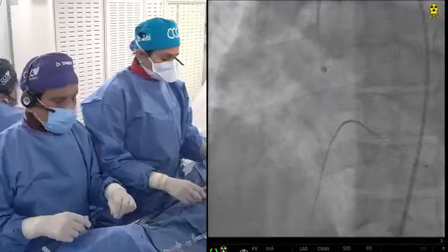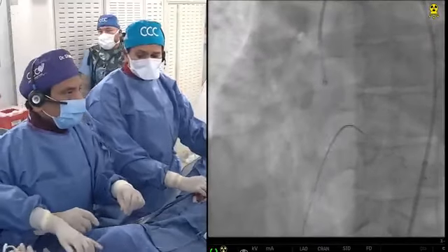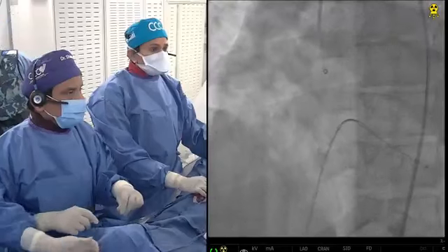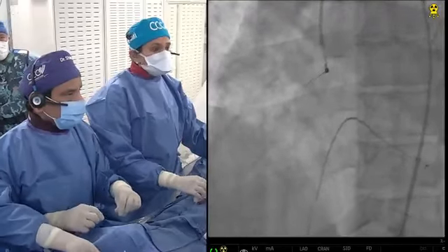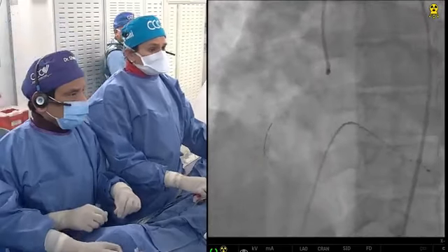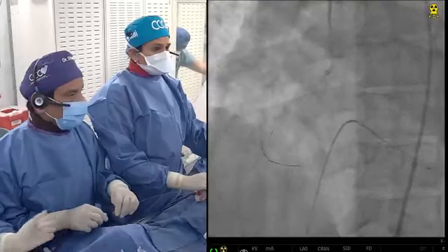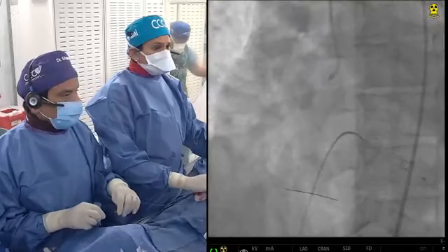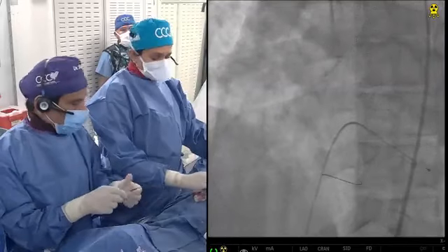Now hold it here. And you come here. You'll show it, Sabina. Not yet. I'll tell you when. Good. Anyway, bring your catheter because we are in the RV branch now. Yeah, good. We are good. Okay. No, no, hold on. The guide can't keep coming out. I know, but put this one now.